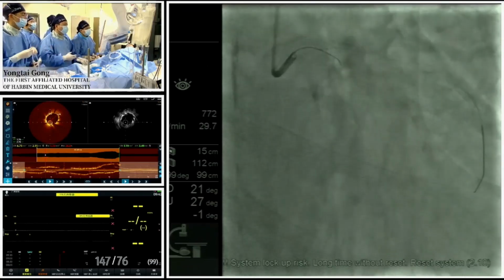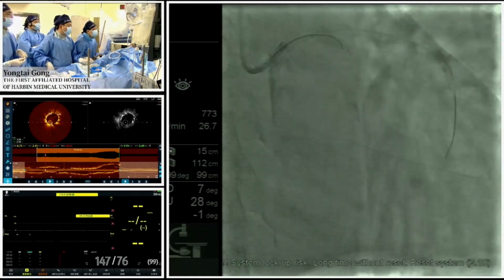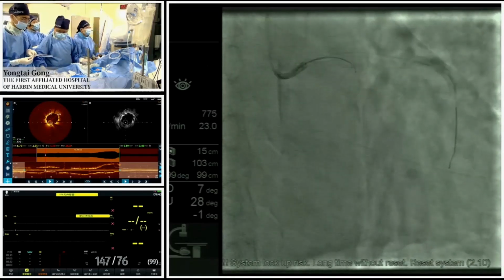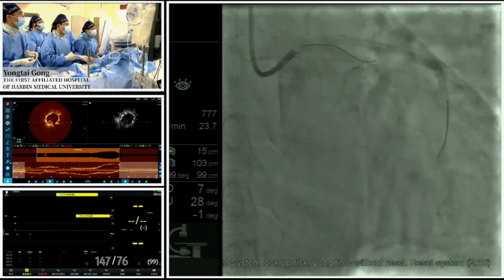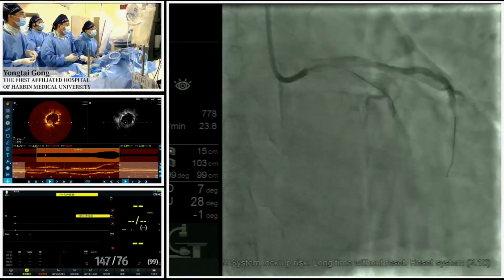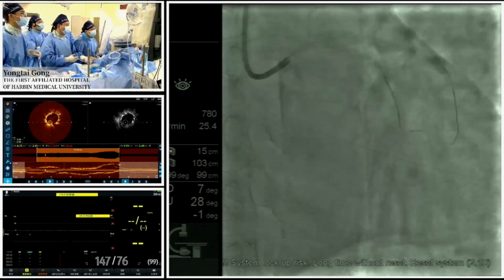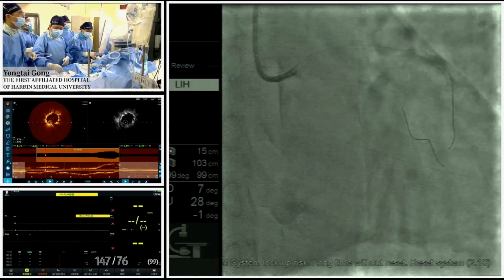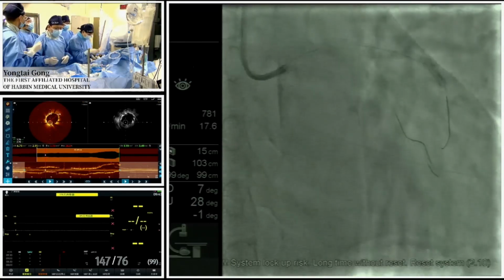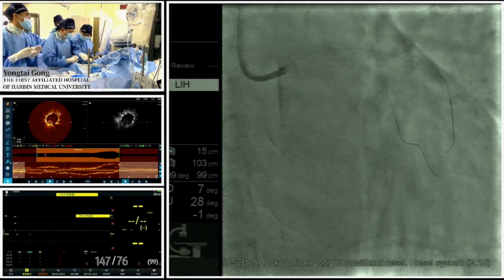The aim of the procedure after LM to LAD stenting is to remove the stent struts at the side branch ostium, to eliminate the stenosis of the side branch and maintain the carina in its central position. Moreover, minimal balloon overlap is recommended to prevent stent deformation and overextension.